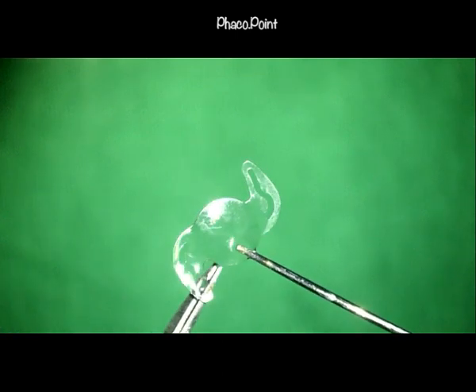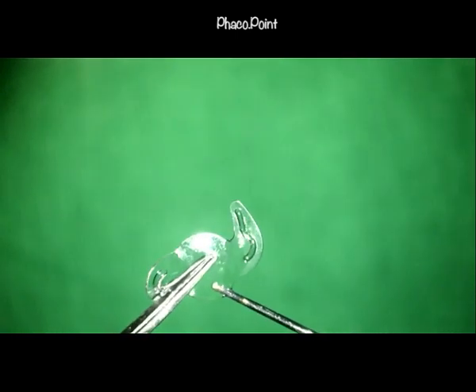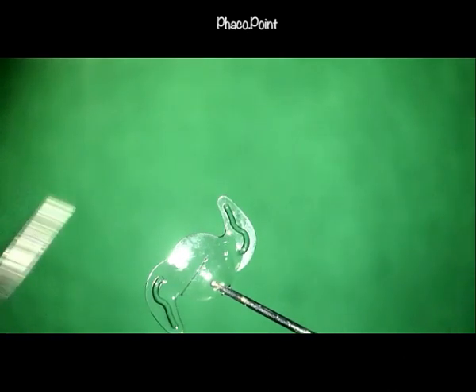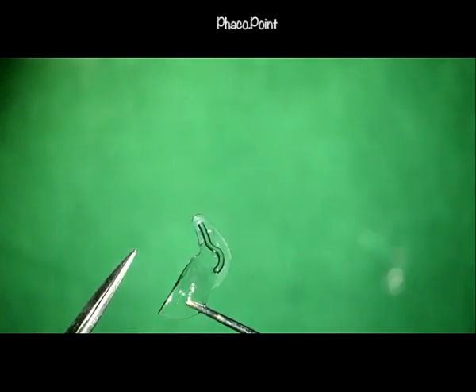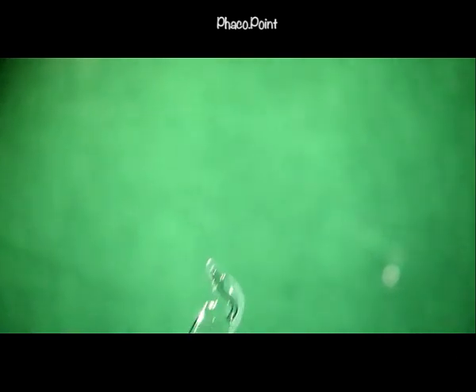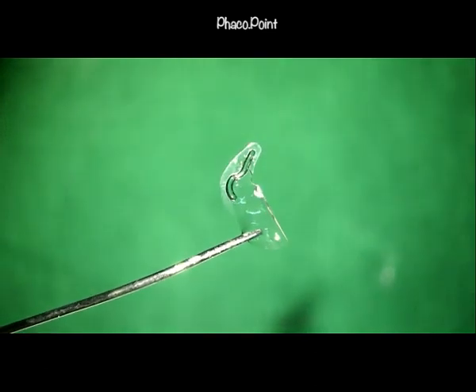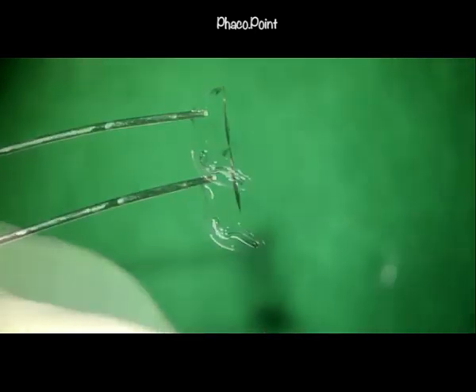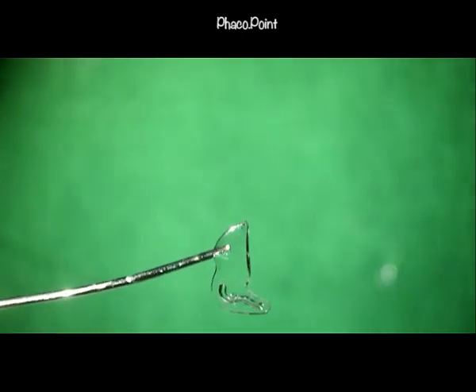The aim is to cut the lens from one optic-haptic junction all the way to the opposite one. One option is to go in and continue cutting the lens all the way across, leaving two halves of the optic each connected to one haptic. With the haptic and optic all in one line, this allows for the removal of each half of the optic in line with its haptic.